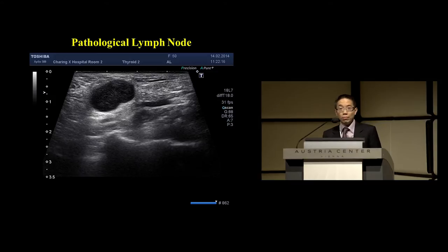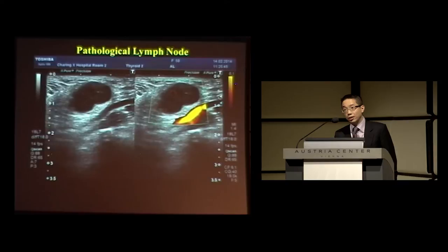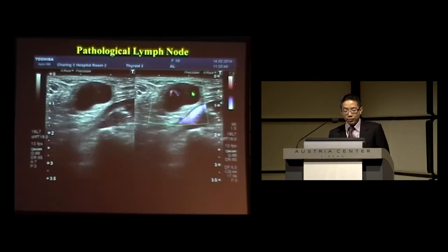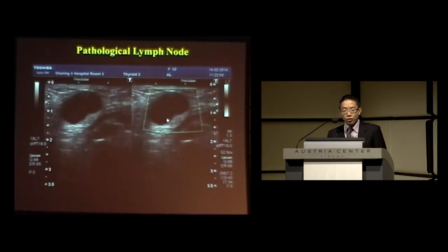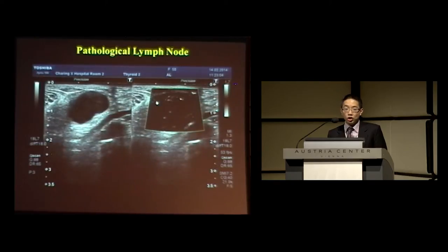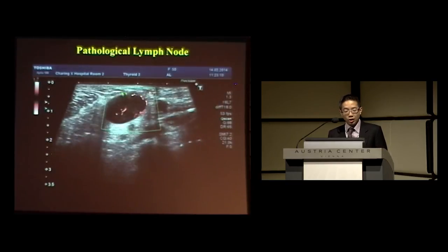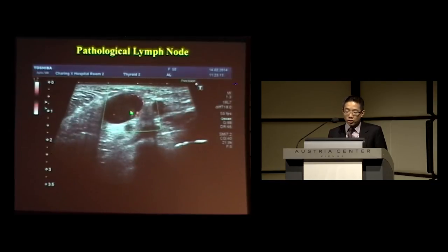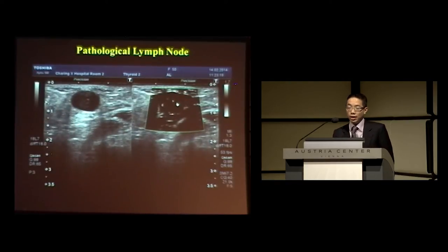It looks pathological on B mode in a patient with a head and neck cancer within the neck. And when we turn on power Doppler, as expected, it's a little bit more vascular. Here it is in ADF again. But when you turn on monochrome SMI, with the B mode version on the left and SMI on the right, what you don't appreciate with the two Doppler techniques is this meshwork of neoangiogenic vessels around this pathological lymph node. When you switch over to the color-coded version, you also get this impression, but perhaps you might appreciate these branching vascular patterns a little bit better with SMI.